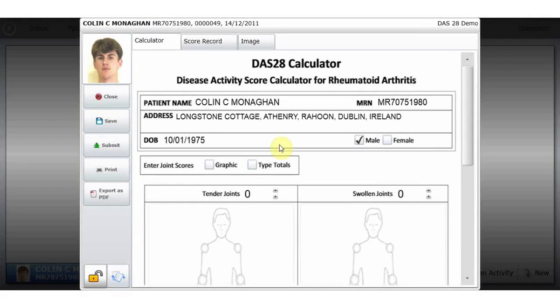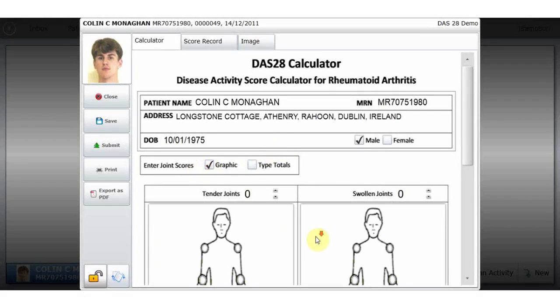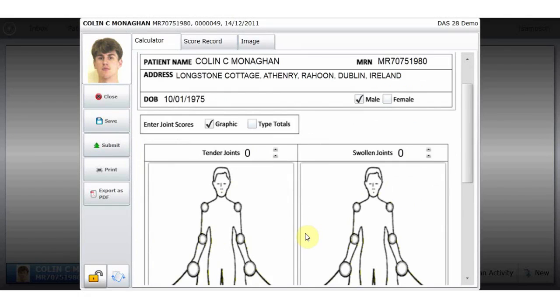The DAS28 is used by clinicians to calculate the level of disease activity in rheumatoid arthritis patients. On the graphic, the tender and swollen joints can be selected.